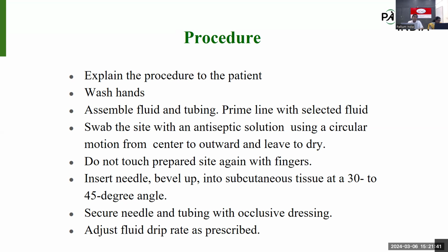Then wash hands and assemble all the equipment that we need and swab the site with an antiseptic solution using a circular motion from central to outward and leave to dry. And do not touch the prepared site again with fingers. It will contaminate the space.